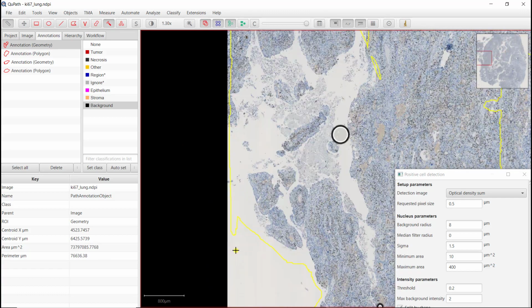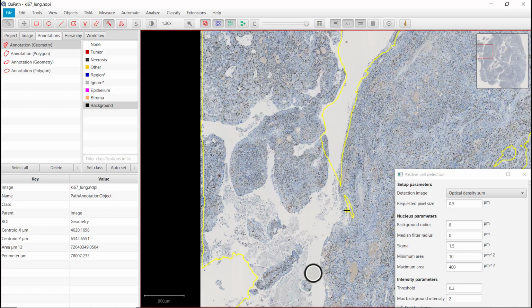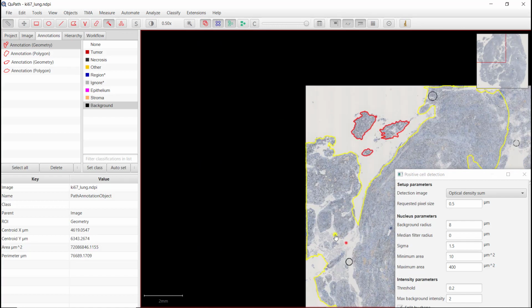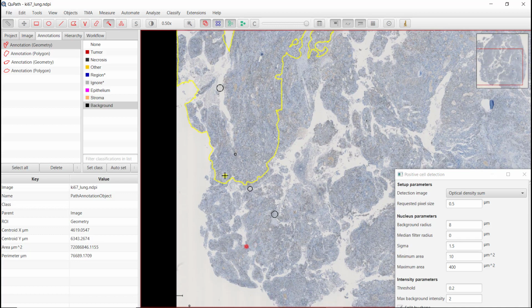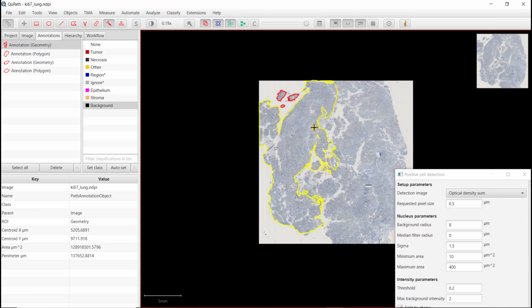Let's say here, definitely don't need that. Let's say it's fine like this. All right. Let's keep adding. So there would be probably more efficient ways to do it, faster ways, but that works. So here, maybe I can go fast like this.